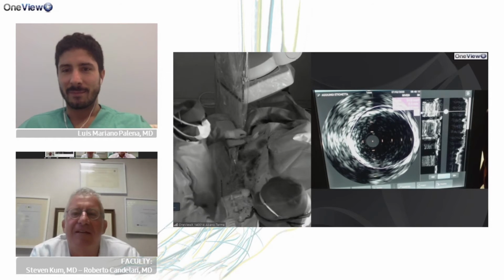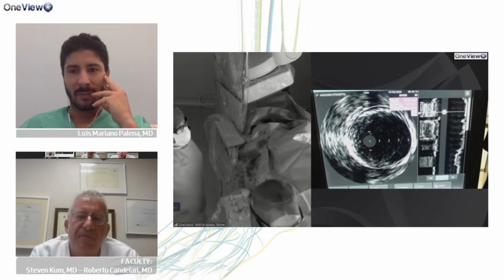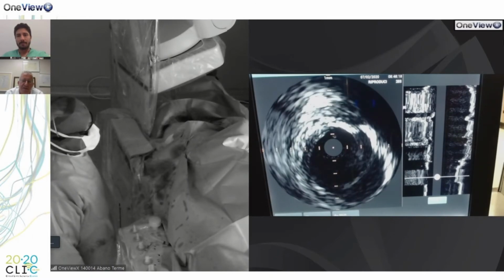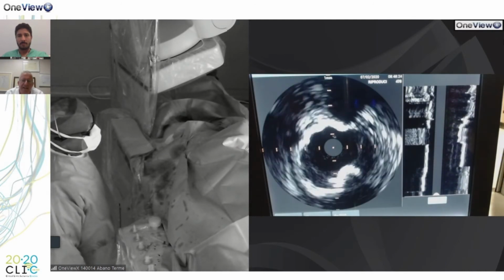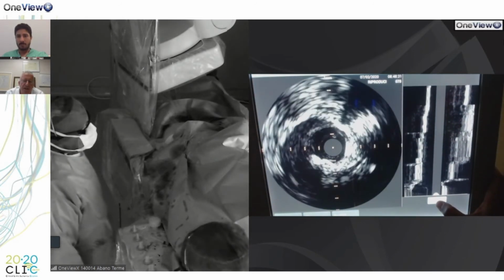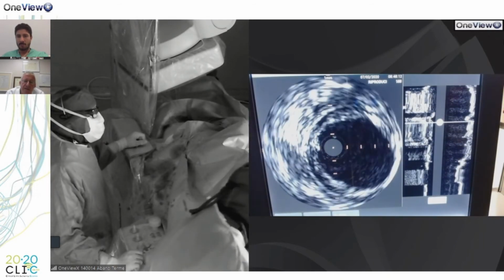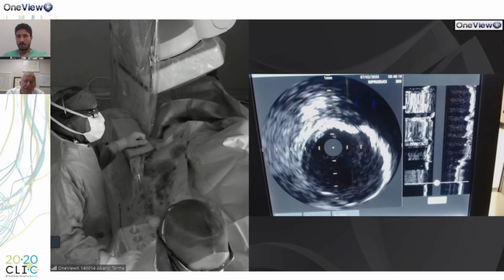Now this is the popliteal tract and SFA where we had the plaque. So can we see the imaging running? Okay, this is the IVUS acquisition, and you will see now the lesion. Okay, so it is easy to recognize the calcium lesion just around, and the bigger calcium lesion at 6. I think that the lumen is not so tight. You can pass through with your catheter.